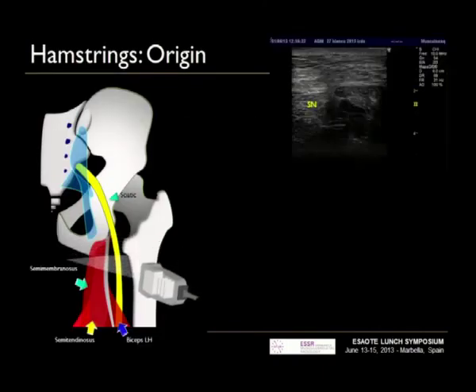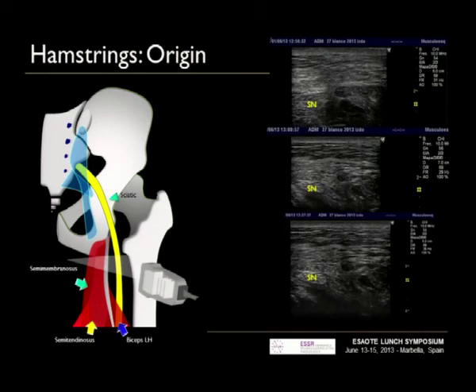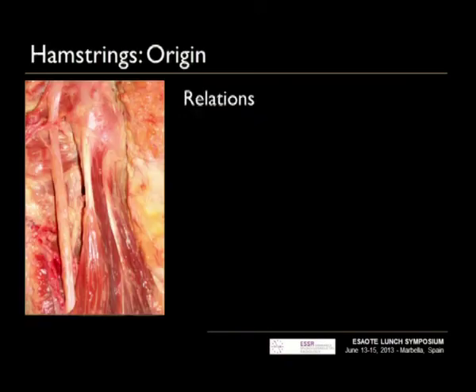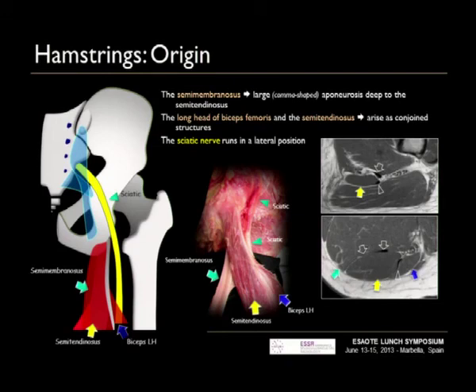If you perform a detailed exam of the upper part of this area, we can see the sciatic nerve — it's a very good landmark — and also the gluteus maximus, the long head of the biceps tendon, the semimembranosus, and how the semitendinosus goes to the medial part. In this MRI, we can see in the more superior part the large comma shape of the semimembranosus, and how it grows and goes into the deeper position under the semitendinosus. We can also observe the aponeurosis belonging to the semitendinosus and the aponeurotic tendon that joins the long head of the biceps and semitendinosus muscles, always in relation with the semimembranosus.